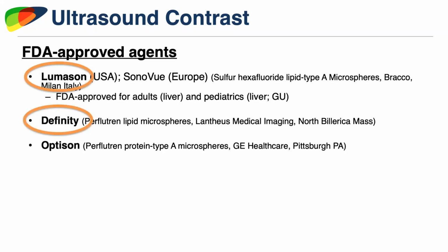Keep in mind there are now several FDA-approved contrast-enhanced ultrasound agents here in the United States. The two highlighted here, Lumason, as it's called in the US, or SonoVue elsewhere, and Definity are likely the two that are the most widely used for liver imaging, at least in the United States today.